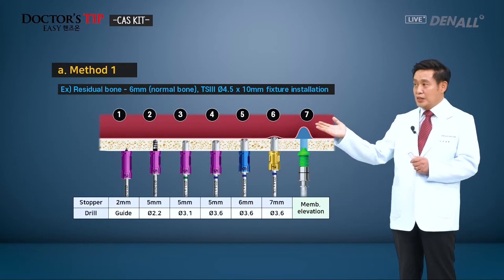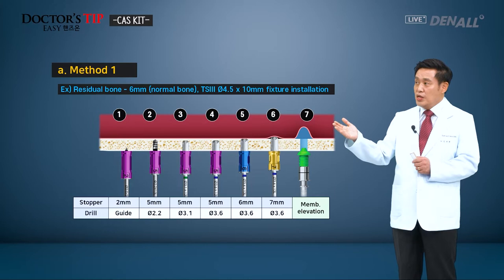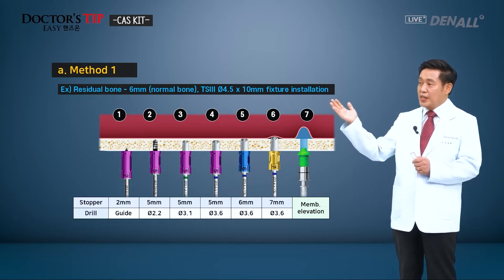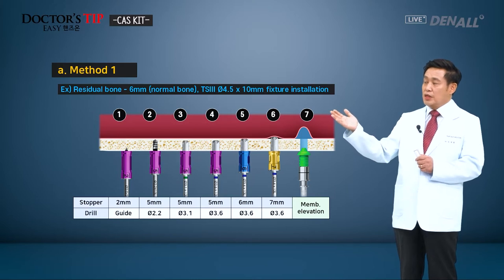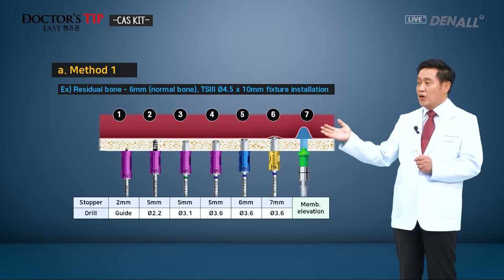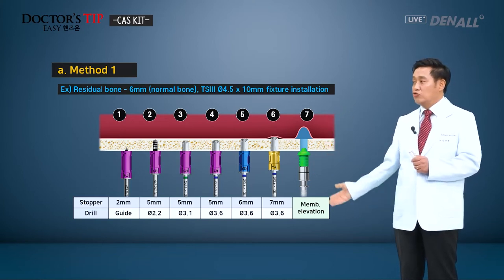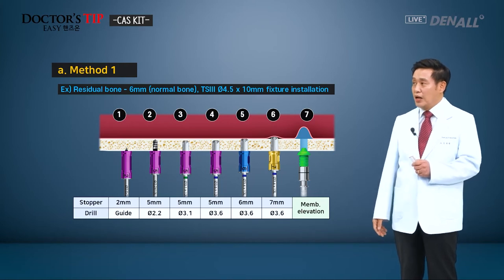In the diagram, as I said before, if the residual bone height is 6 millimeters in normal bone, with the 2 millimeter stopper, the guide drill is used. Still, 5 millimeter high bone remains. Using a twist drill, we go up to 5 millimeters. CAS drill is used, 3.1 and 3.6, using the same 5 millimeter stoppers. Then 3.6 is used to advance into 6 and 7 millimeters. Sinus floor can be penetrated without damaging the membrane using the hydraulic elevation.